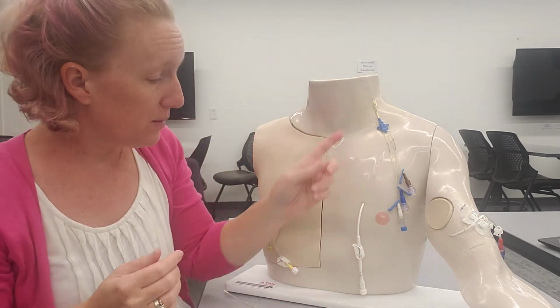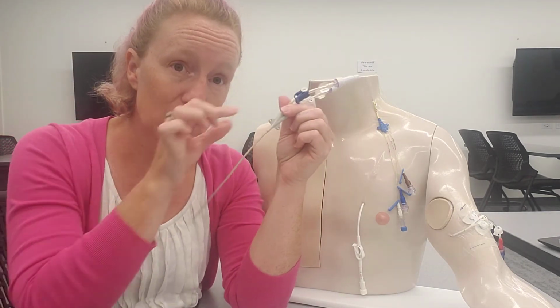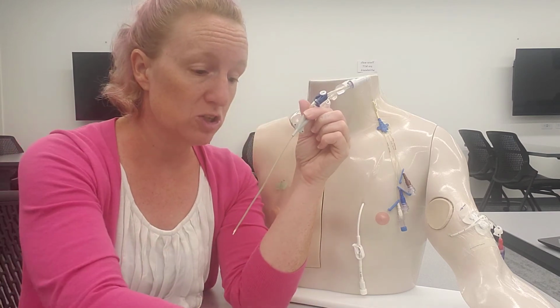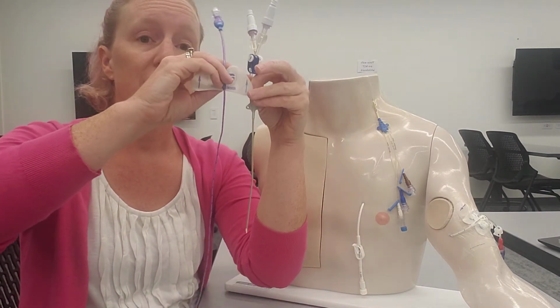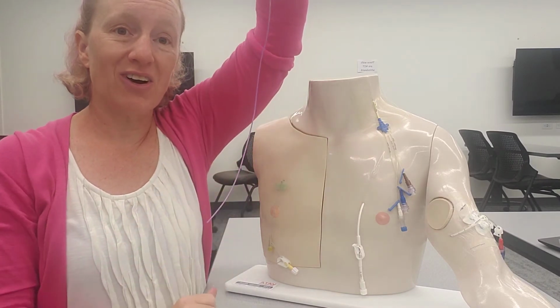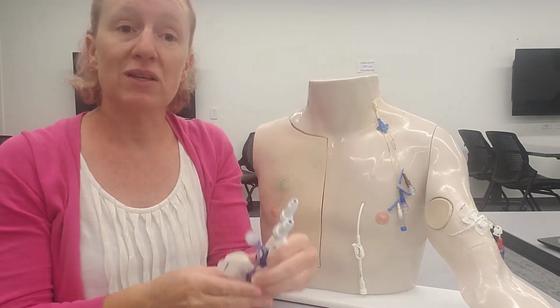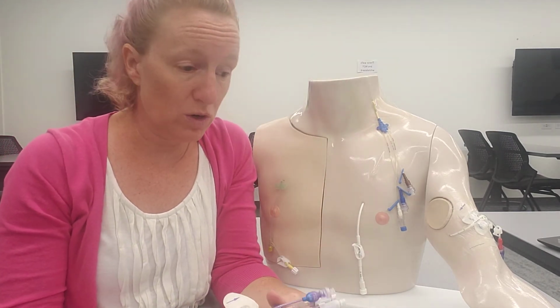Something we kind of talked about, these lines on the IJ, they're really short. So again, that infection risk is so much greater. You have a PICC line that keeps going, and so our infection risk is less. It's still there, so that becomes something that we have to really prioritize and work with.